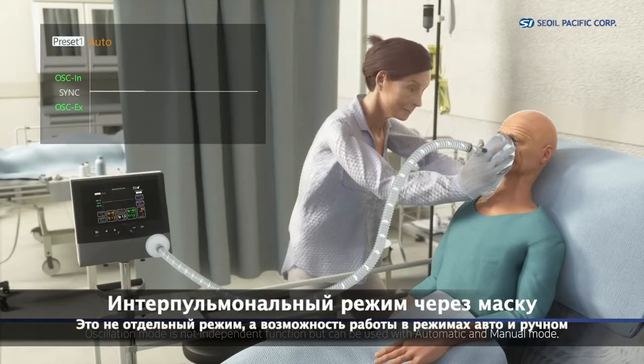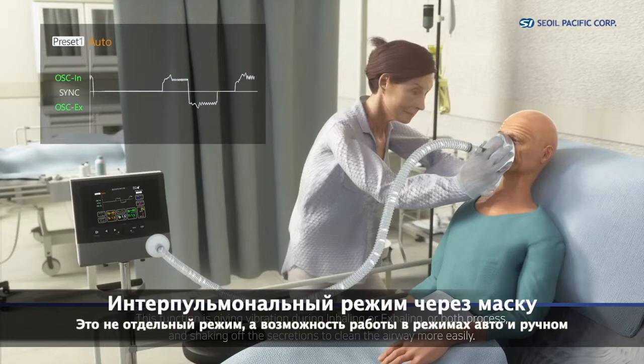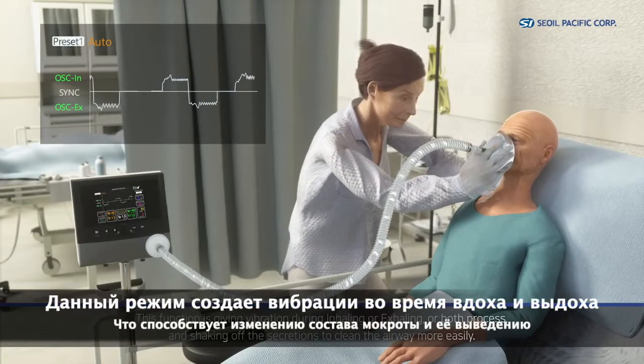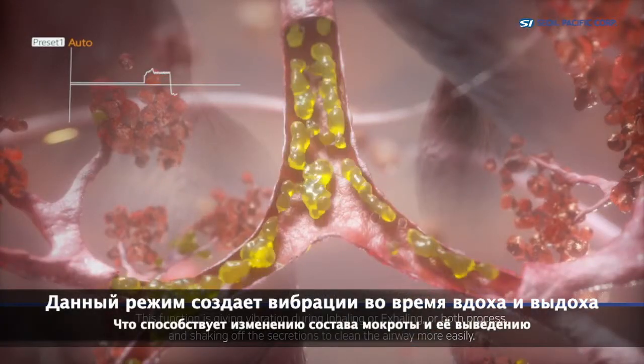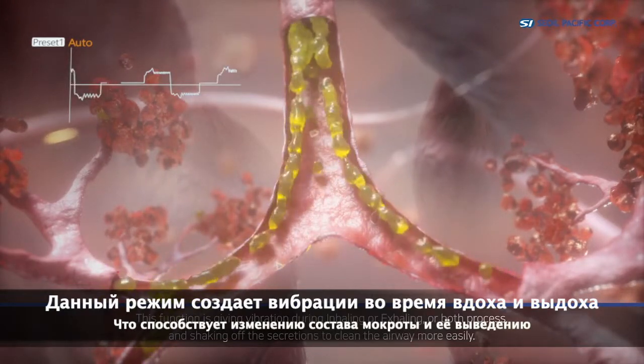Oscillation mode is not an independent function but can be used with automatic and manual mode. This function gives vibration during inhaling or exhaling or both processes, shaking off the secretions to clean the airway more easily.